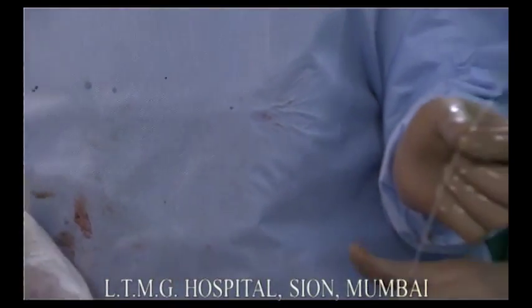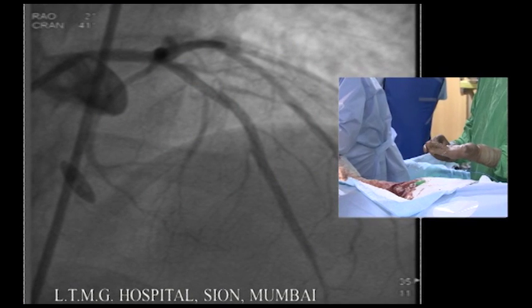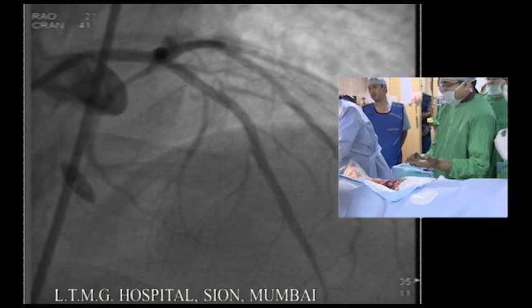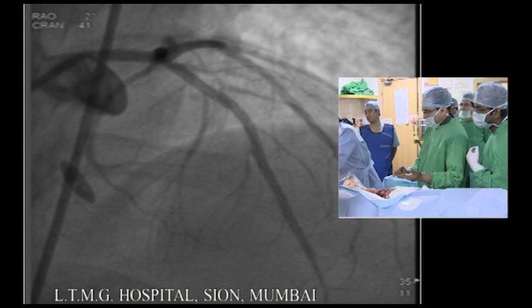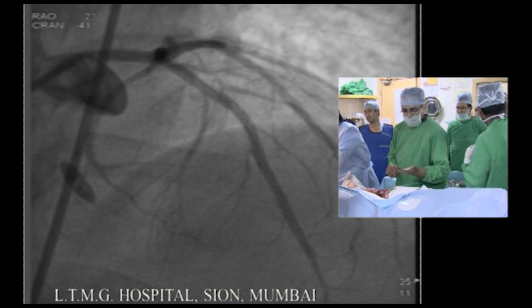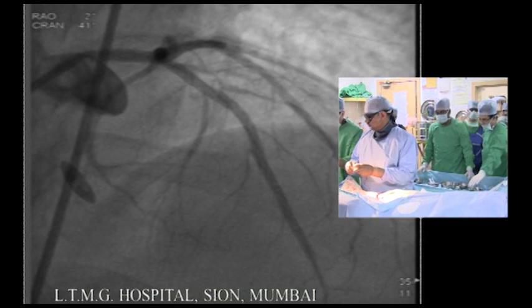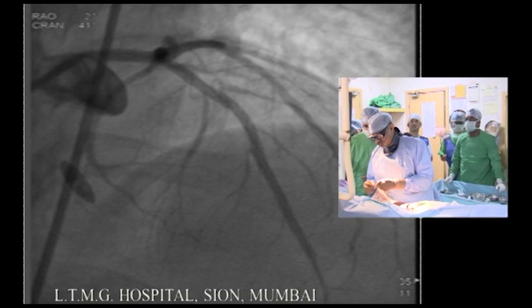But right now, if you ask me, in our lab we probably use around 10%. I might be using a little bit more, maybe about 40%, but not in everybody. But if it is left main, ostial LAD, those are the patients we use it a lot more. But for this patient, even in our lab, I cannot say that we would have used an IVUS regularly in each and every patient. Of course, it's a live case. We want to show something for our audience. We want to do it.